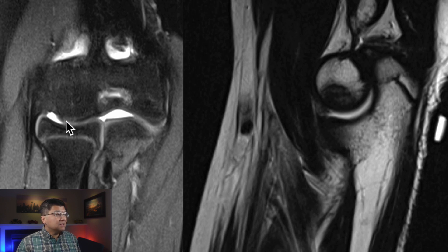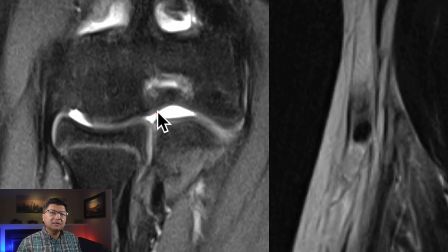Oftentimes the demarcation of where the capitellum ends and the trochlea begins is ill-defined. The way I like to think about it is with the articulation. We know that the radial head aligns with the capitellum. So if we can draw our radial head, we know that here is where our capitellum is going to be — this is the condyle of the capitellum. Conversely, if we know where the radial head ends, everything on this side has to be your trochlea.